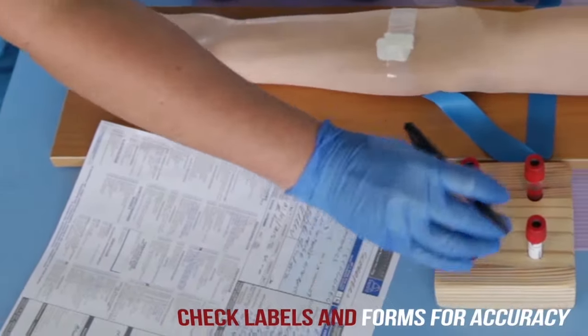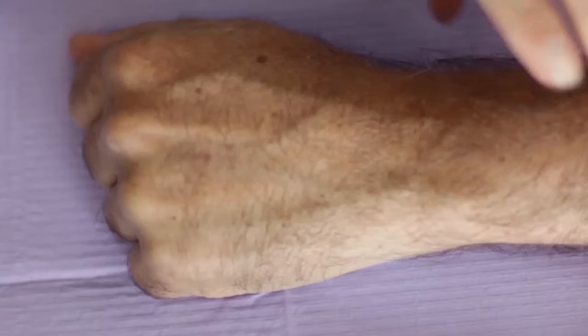Check labels and forms for accuracy. Perform hand hygiene.